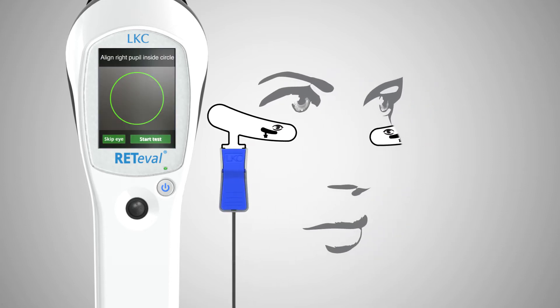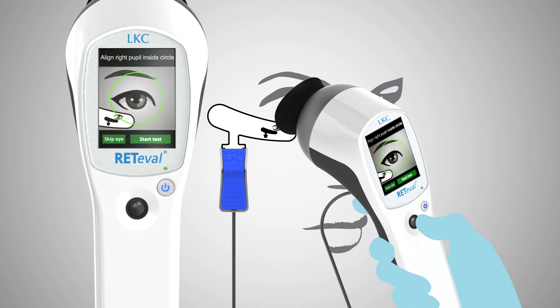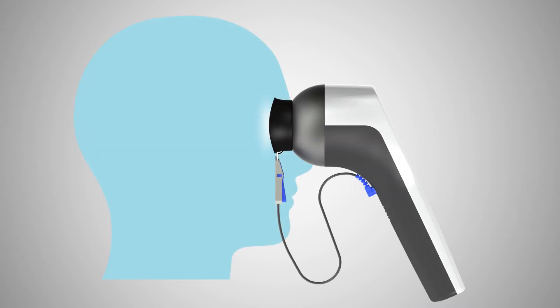Position the device over the patient's eye under which the sensor strip is connected. Ask the patient to look at the red fixation LED and, using the live video provided by Redaval as a guide, position the pupil of the eye within the green circle shown on the display.